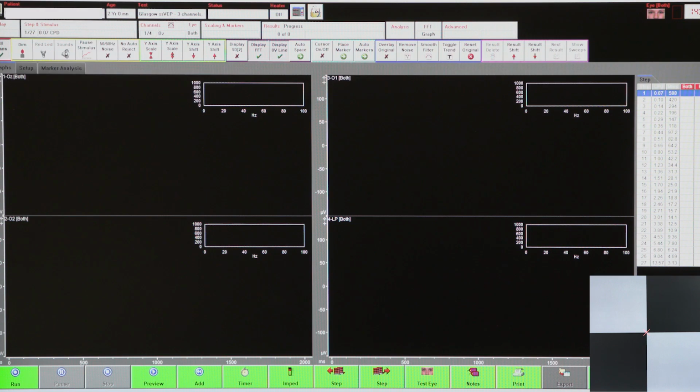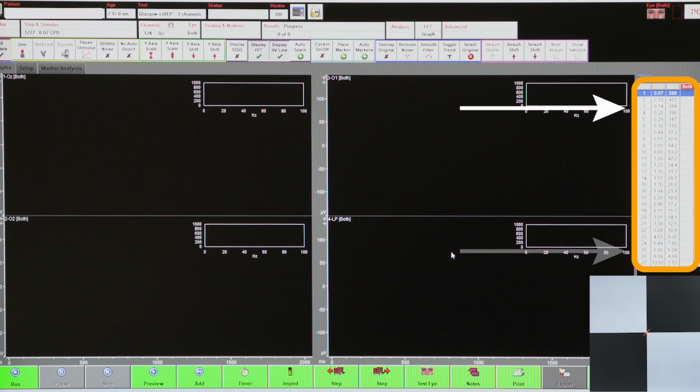Now let's have a look at a couple of examples where we can watch the operator screen in detail, and we're also showing the stimulus screen in the lower right corner, so you can see how the real-time analysis governs the stimulus check size. Now let's orientate ourselves here. We have 4 VEP channels, OZ, O1 and O2, each referenced to FZ, and in the bottom right our Laplacian channel. On the right-hand side of the screen, we have our list of available check sizes, from very big checks up here at the top to very small checks at the bottom.